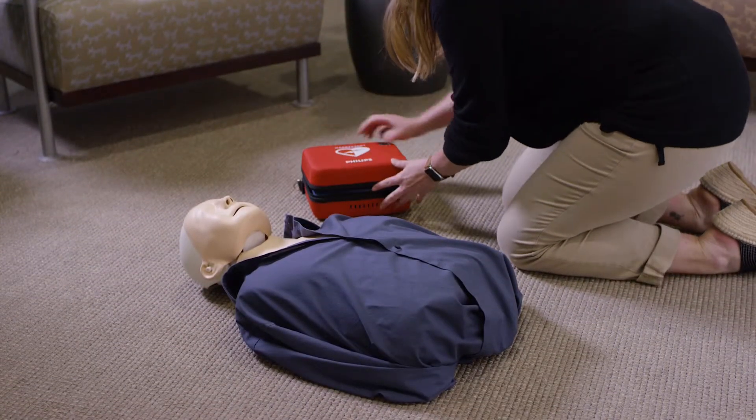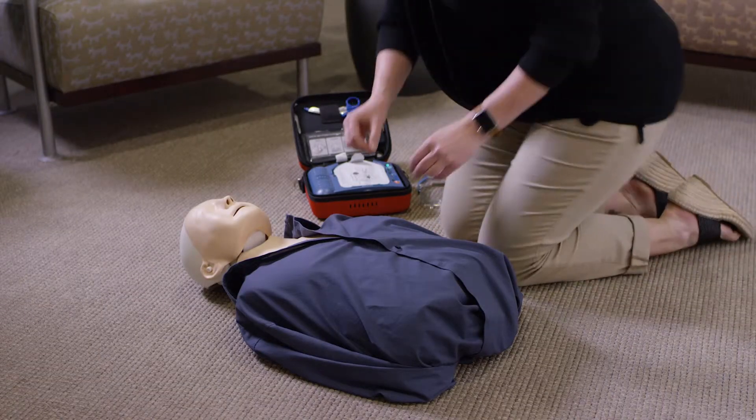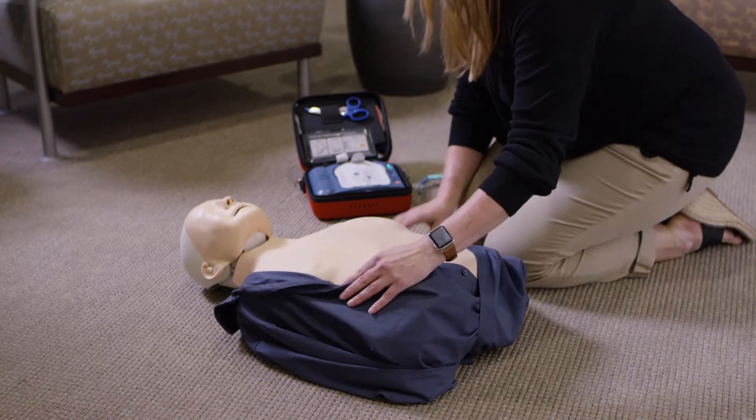All you have to do is open the AED by pulling this lever down and the device turns on automatically. Begin by removing all clothing from the patient's chest. Cut clothing if needed. Then just follow the clear and calm voice instructions.